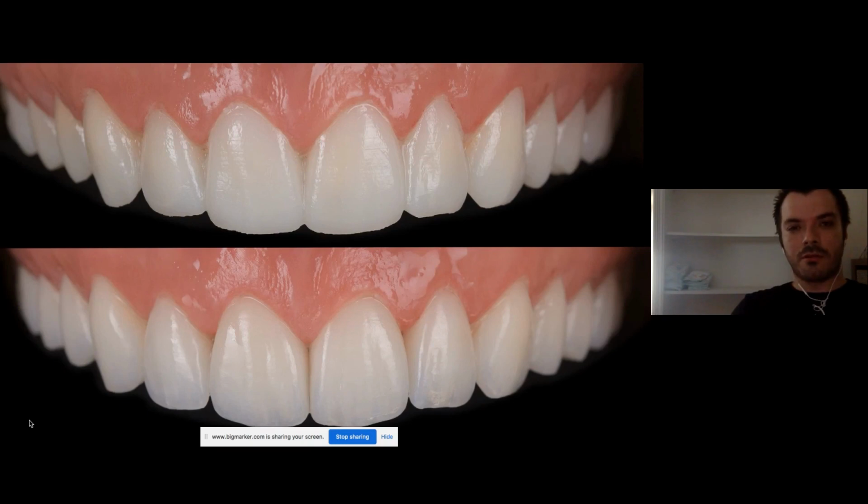You're choosing a library virtually first, no resource, no wasted time, easy communication, easy way to go back and forth. Once it's decided, then first step, download the library, put it on top of the morphology to have a motivational mockup. You can do that in a free software if you want.